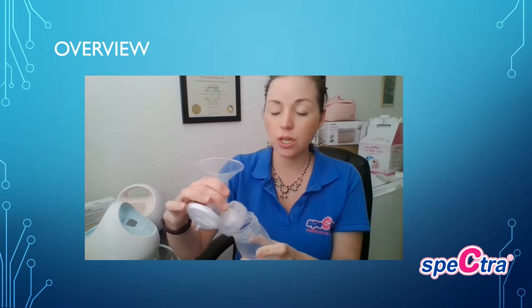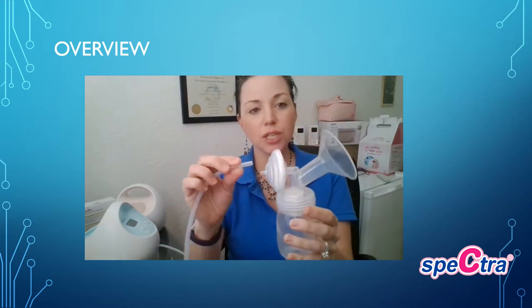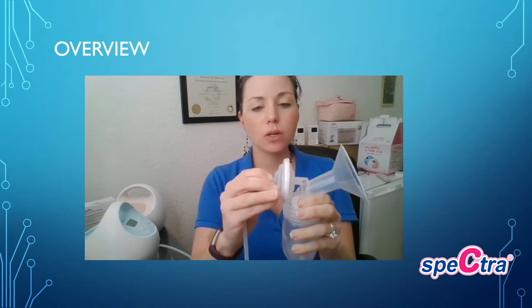We recommend that you gently screw the backflow protector into the back of the flange. The collection bottle — you would unscrew the lid; it has a lock mechanism to ensure it stays on the flange and not lose any of the precious milk. The tubing is going to go on the other end of the backflow protector. Make sure this is secure, and that you've properly secured the duck bill valve onto the actual flange itself.